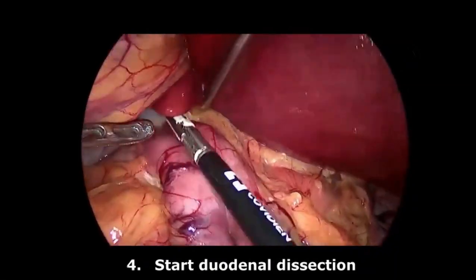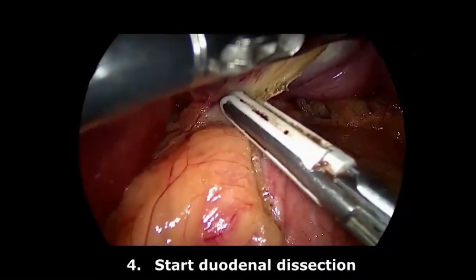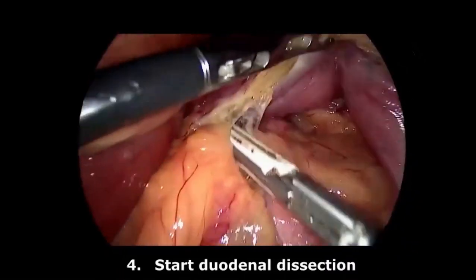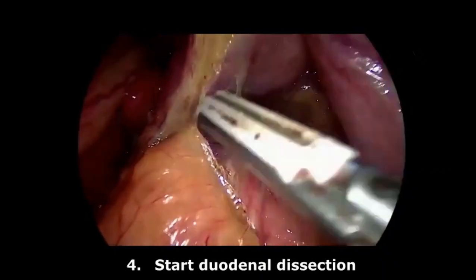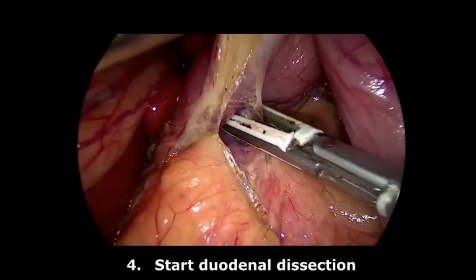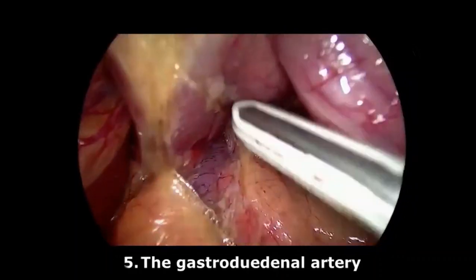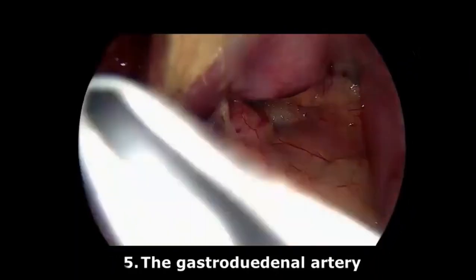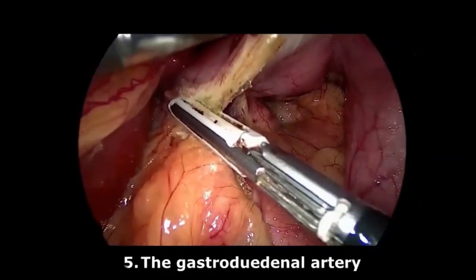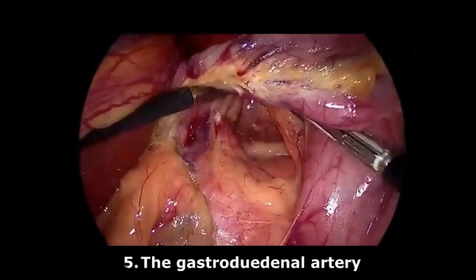Look from above to appreciate where the pylorus is, then continue the dissection. When I push the pancreas down, I can see the gastroduodenal artery. This is the main landmark. These are our rules: verticalize the duodenum and push the gastroduodenal artery down. When I do these steps, I can see clearly that I have a clear landmark for the further dissection.